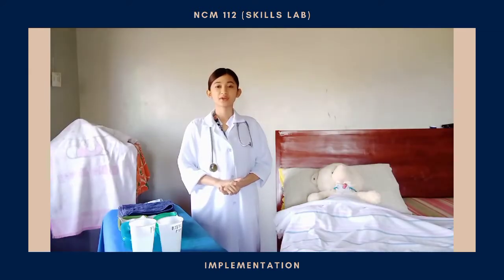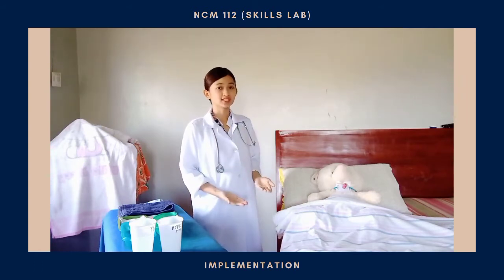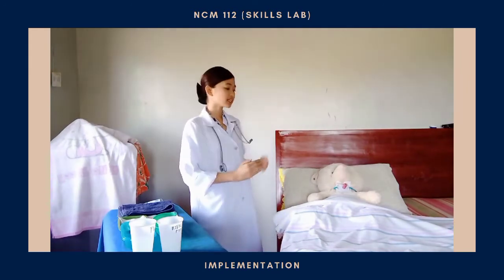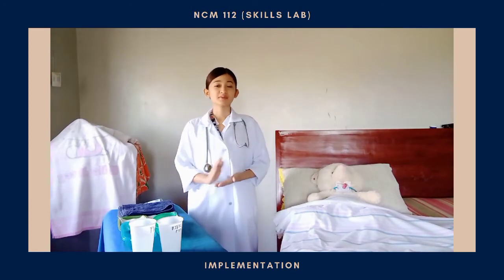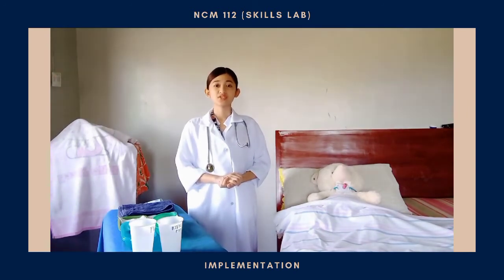Adjust the bed to a comfortable working position, usually at elbow height of the caregiver. Then lower the side rail closest to you. And if the patient is conscious, place her in a semi-Fowler's position. But if the client or the patient is unconscious, place him or her in a side-lying or a lateral position and facing you.